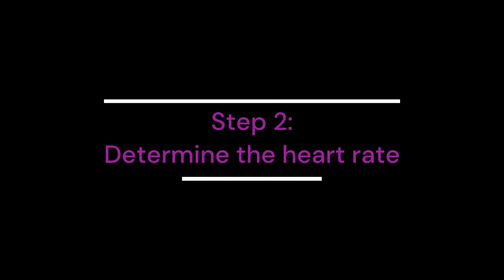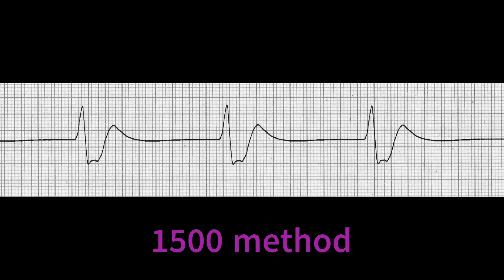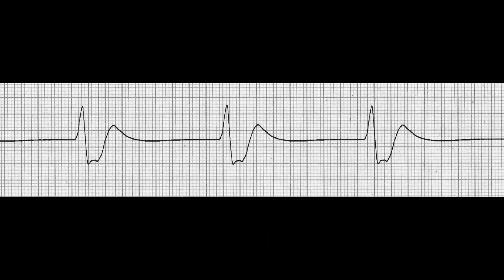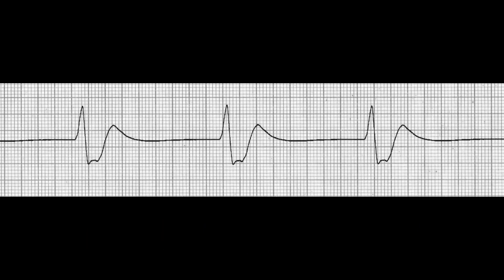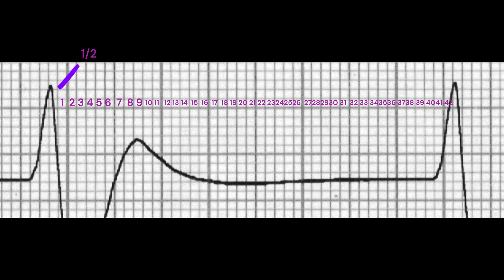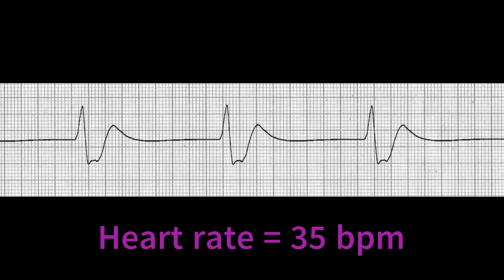Step 2: Determine the Heart Rate. Idioventricular rhythms have a slow rate of 20 to 40 beats per minute. In this example, we can use the 1500 method to determine the heart rate. Take note that we can use this method on regular rhythms only, which this example is. The number of small blocks in the R to R interval is 42.5. We divide 1500 by 42.5 and we get 35.2, or rounded down to 35 beats per minute.